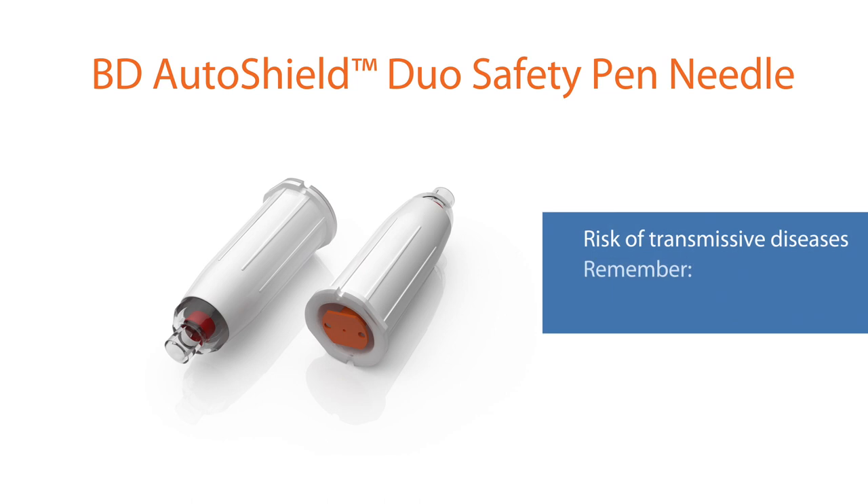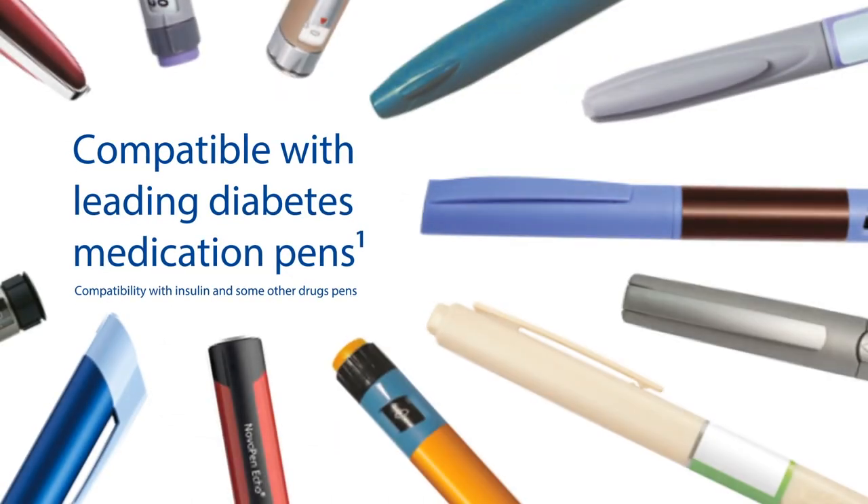A red indicator band automatically deploys with the shield after use, confirming that it is locked and the needle has been used. Remember: one patient, one pen. The AutoShield Duo is compatible with leading diabetes medication pens.